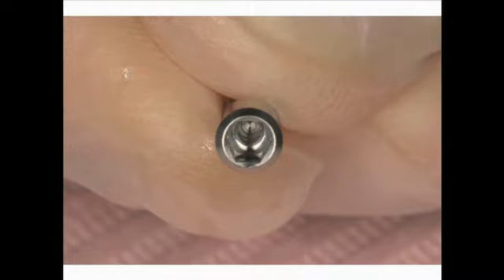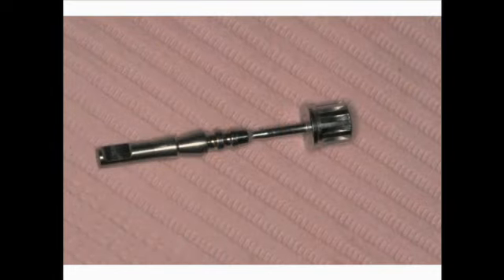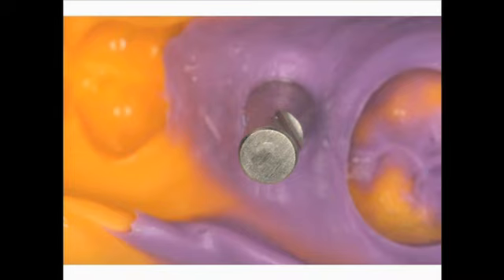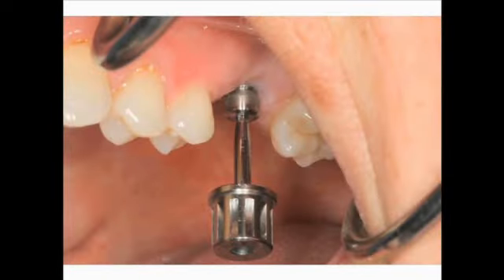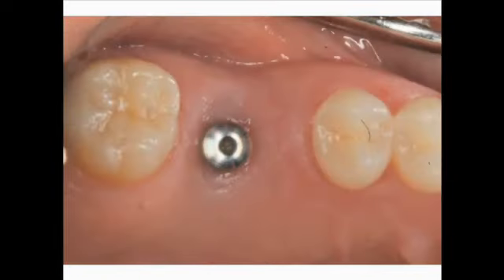The impression coping is placed into the implant analog used by the dental laboratory to simulate the actual implant position in the mouth. The impression coping and analog are placed into the final impression. The healing abutment is replaced and torqued into position while the dental lab fabricates the prepared abutment and crown. And again, the healing abutment is in position. The dental laboratory will then prepare the titanium abutments and the final crowns that we will place in the mouth.